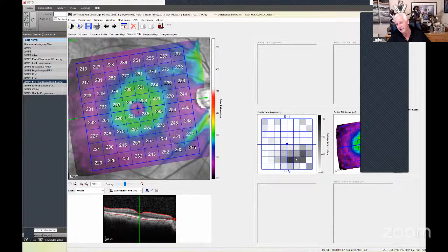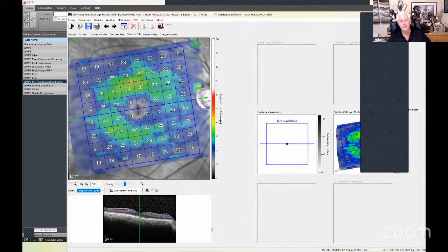There's not really any obvious asymmetry that we would associate with glaucoma that we can see in that asymmetry map. And if I go to my ganglion cell layer, it's very thin. The ganglion cells almost are shot, especially over here. And you say, oh, look, there's some notching there. That's a glaucoma notching. I say, I'm sorry, that is not the right location for the notching that we expect in glaucoma. We would expect it to be over here, coming temporally towards the fovea, not nasal and temporal to the disc.